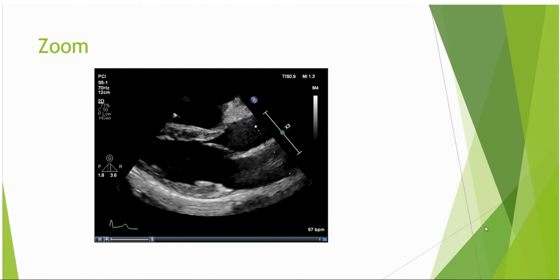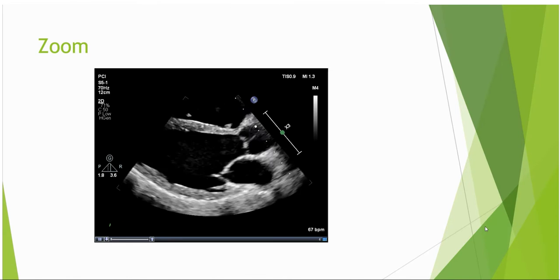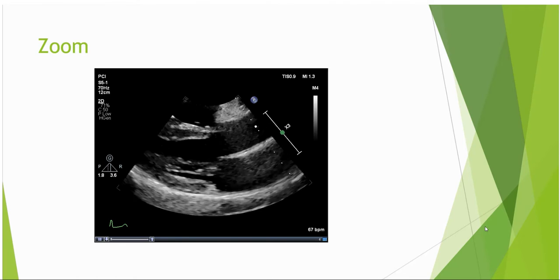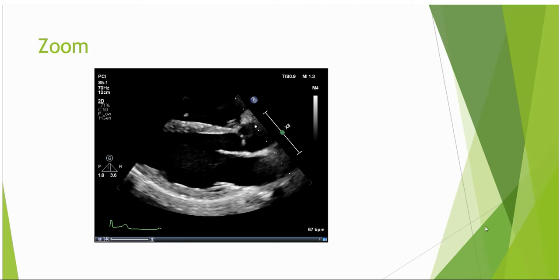In applying zoom, frame rates will increase as we have decreased the width of view and there is no need to wait for echoes returning beyond the depth of the box. So zoom has the advantages of increasing spatial resolution and temporal resolution.